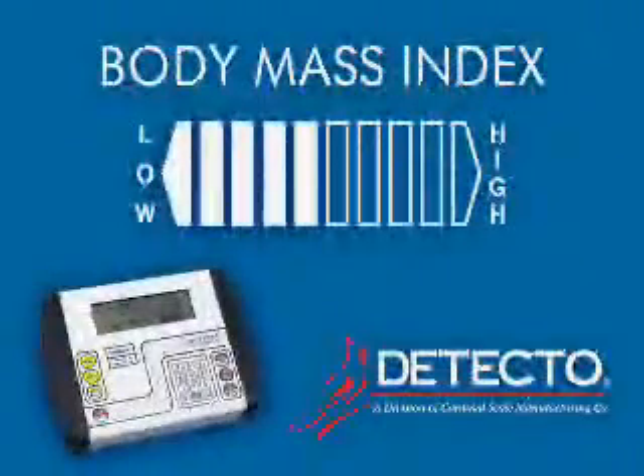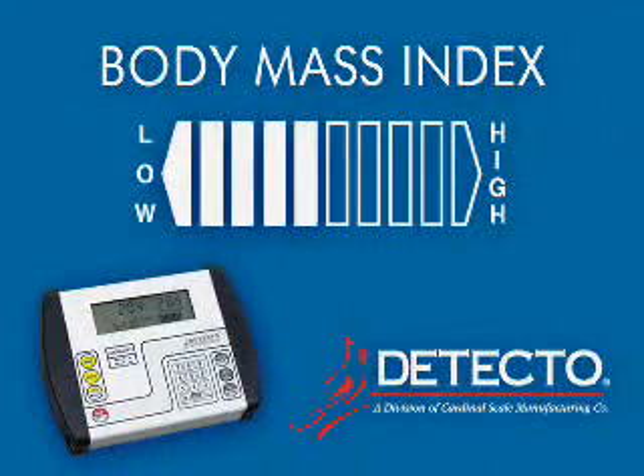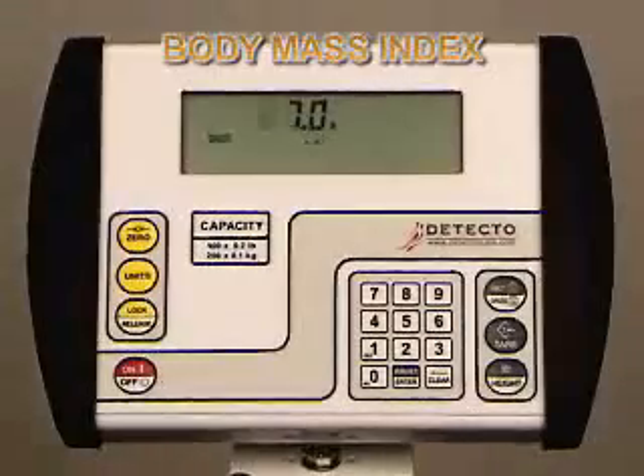The 758C indicator can calculate body mass index for you. Body mass index measurements have been shown to be an accurate estimate of health risk when used as part of a comprehensive health assessment. The 758C quickly calculates BMI by simply entering the patient's height while weighing. To factor BMI, a patient should be weighed on the scale, then press the ID height key.